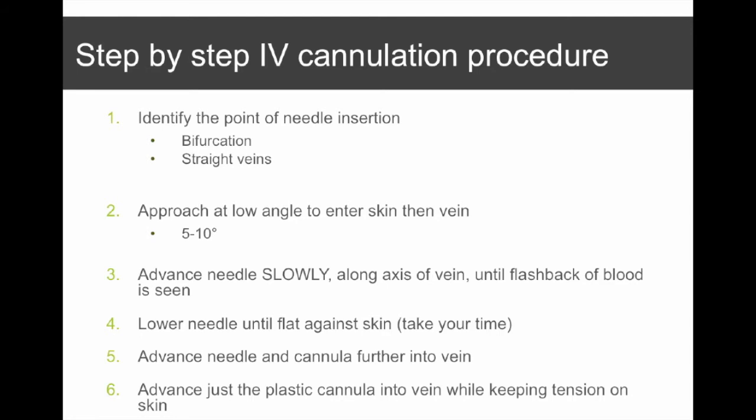Now, I always tell my students to advance the needle slowly. You want to know exactly what you're doing and know exactly at which point you get flashback, and there's a number of reasons for that. So I advance slowly along the axis of the vein until flashback of blood is seen. At that point, I stop advancing. You then lower the needle and the cannula together until they're flat against the skin, and take your time with this. The patient will be absolutely fine.